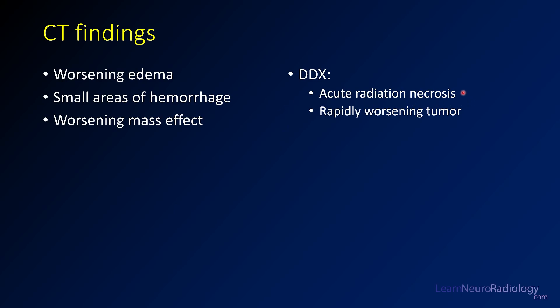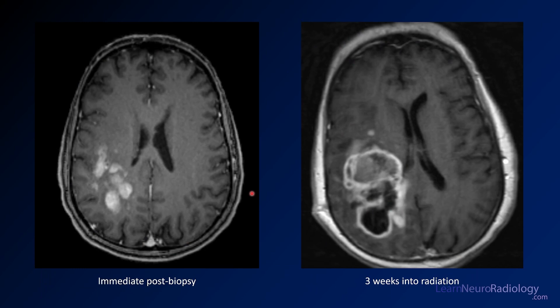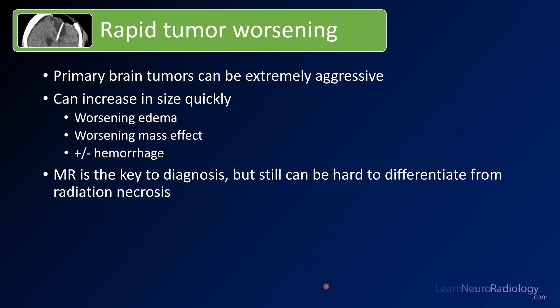The differential for this is acute radiation necrosis or rapidly worsening tumor — you can't tell the difference on CT. When you make your CT impression, you want to say there's significantly worsening edema and mass effect in the known tumor bed, either rapid tumor worsening or radiation necrosis. They may go on to get an MRI, but they should be aware of these acute findings. On the post-contrast imaging, the immediate post-biopsy showed some nodular enhancement; three weeks into radiation it's substantially worse — a lot more mass effect, more enhancement, some areas of necrosis. This patient was transferred to hospice, described as rapid tumor worsening. These tumors are extremely aggressive and can increase in size rapidly. MRI is key, but describing the mass effect, hemorrhage, and worsening of those findings helps guide management.